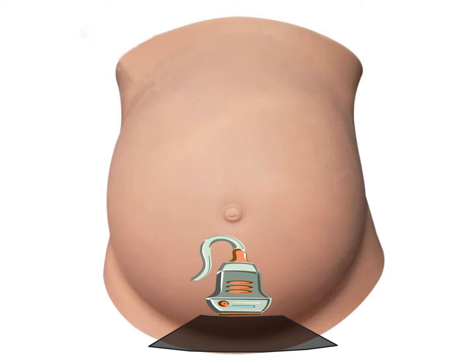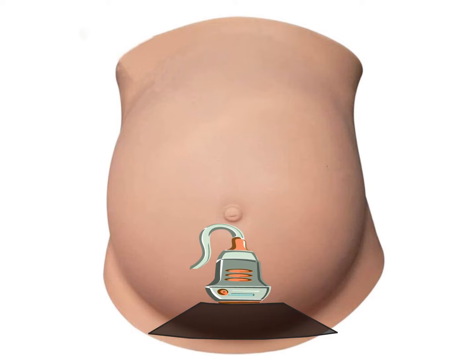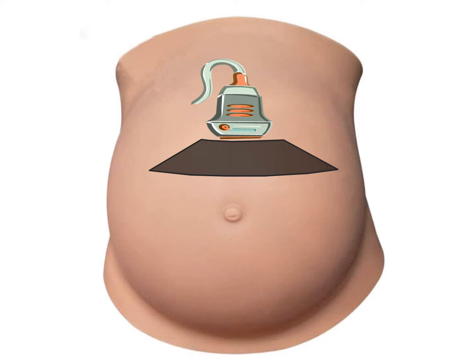Now this is called a fundal sweep, and I find that this is the most effective way to orient myself to the fetuses in a multiple scan, and this is done by placing the transducer in the lower maternal abdomen in a transverse format and then sweeping cephalad on the maternal abdomen, and this gives me an overview of where the fetuses are positioned within the amniotic sacs.